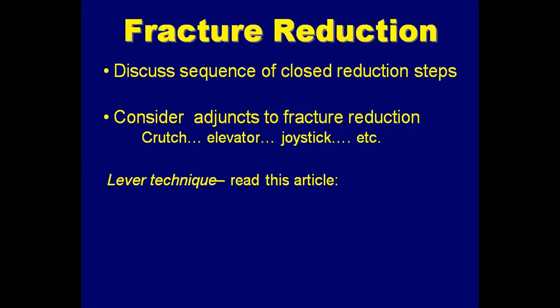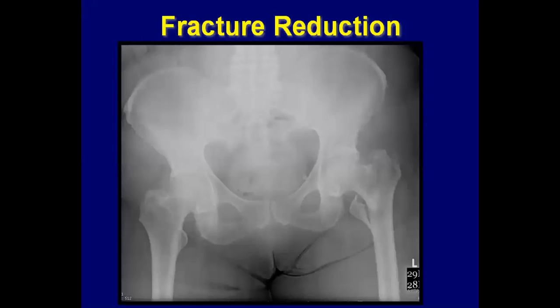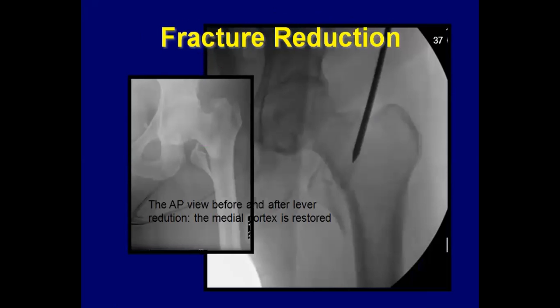Coming to the fracture reduction, if we try to reduce with the closed reduction in AP and lateral view, I think that is the best way. But if the reduction is not acceptable, even in the lateral view or AP view, we must go inside the fracture site, either with open reduction or even with closed reduction, put the Steinmann pin or thick K wire and use them like a joystick and reduce the fracture in both the planes, AP and lateral. And in the lateral view, see the anterior cortices. If they are at the same level, then you can proceed with putting the implant.